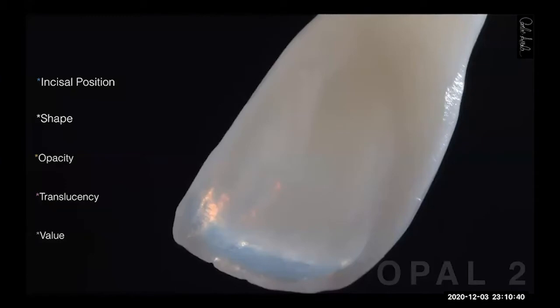Normally we cut back from buccal and we add ceramic, but we know that normally the ceramic contracts, so we never get the same position. We get close, but we never get the same position. With the scoop, yes, because you do the carving from lingual.